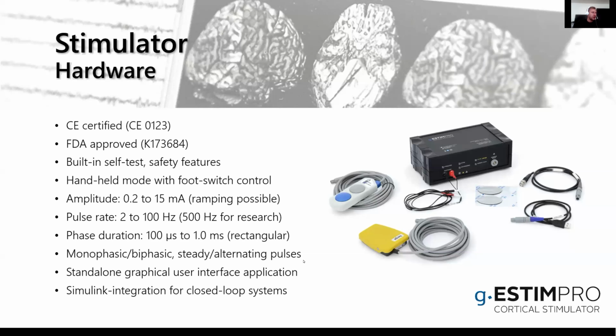I will come to the polarity later. That is also a very powerful feature to switch the positive and the negative polarity, to start with a positive phase and then have the next pulse start with a negative phase, because by that you can cancel out a bias in the responses due to the electrical stimulation artifact.